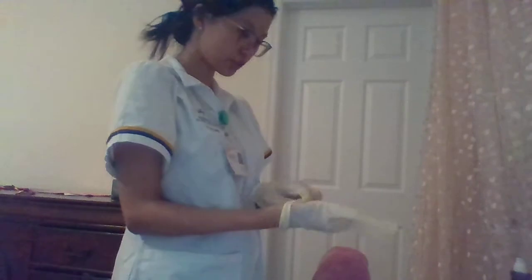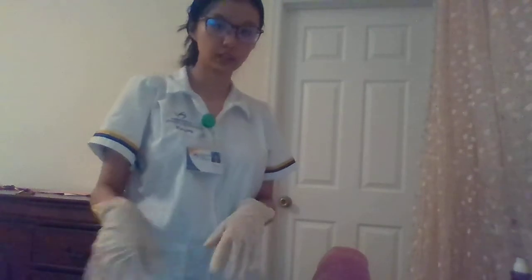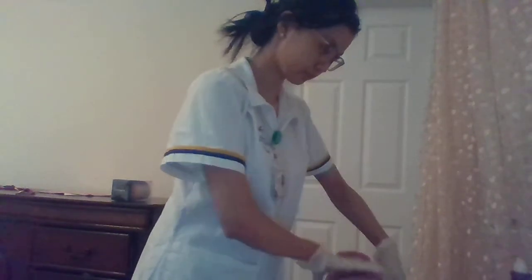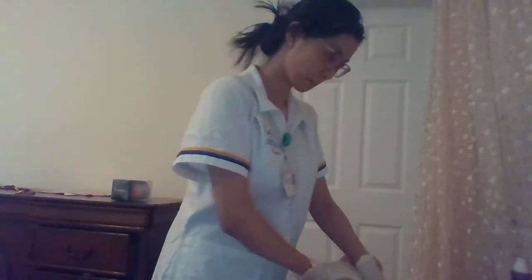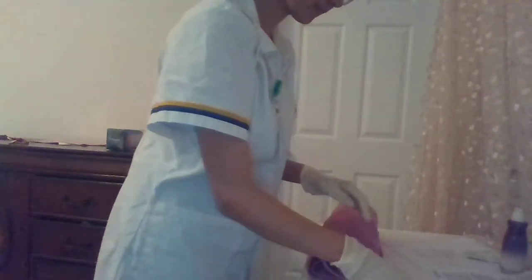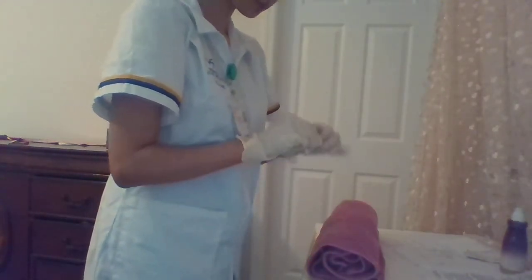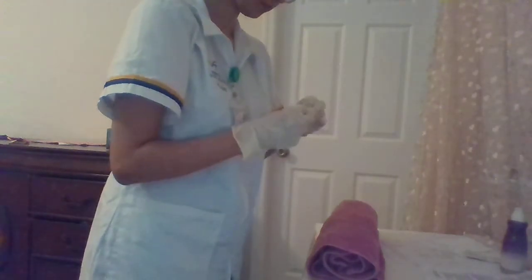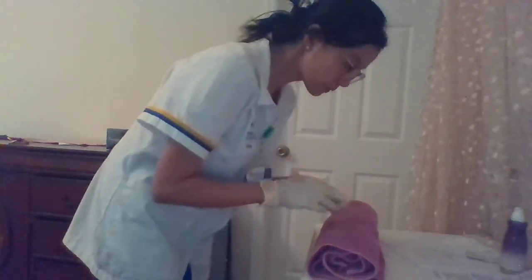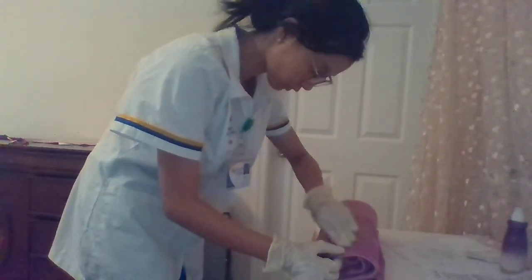I'm going to position the patient relaxed, letting the patient sit down on the chair and put the arm on a firm surface. So I'm going to use the deltoid. So this is my arm. And before I inject, I'm going to clean the skin in a circular motion. I start at the center and then move outward.